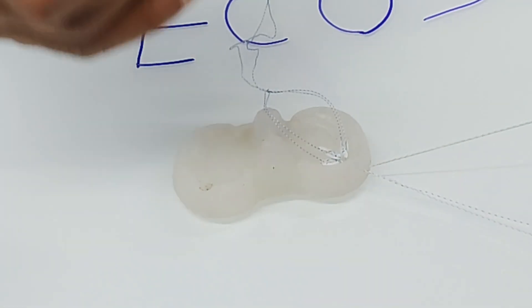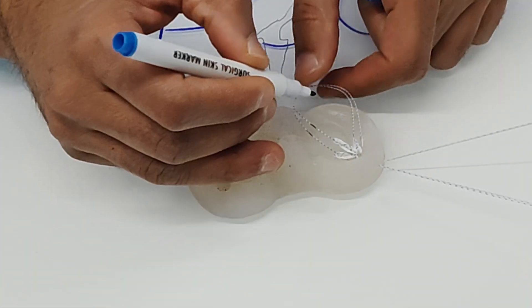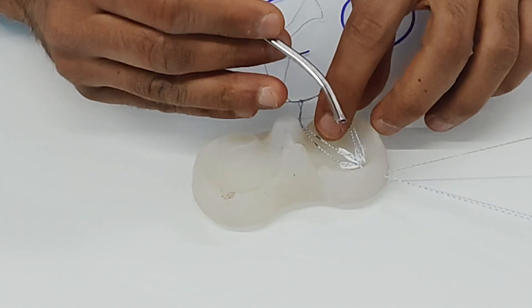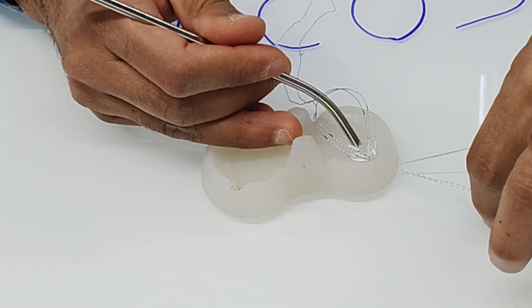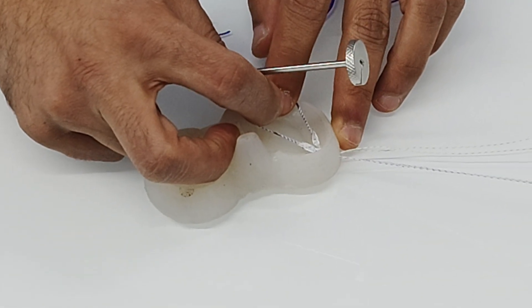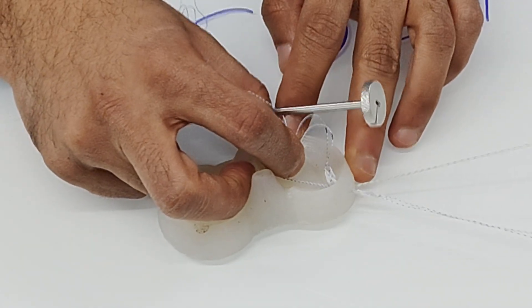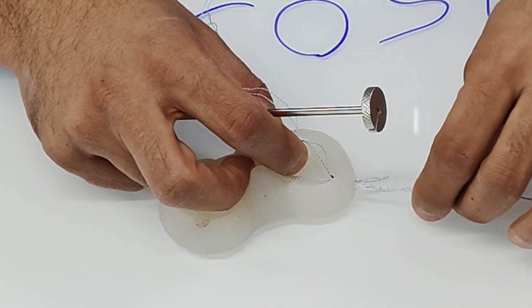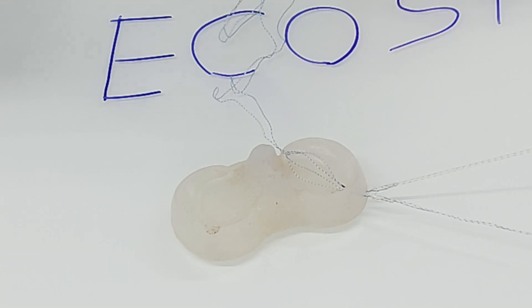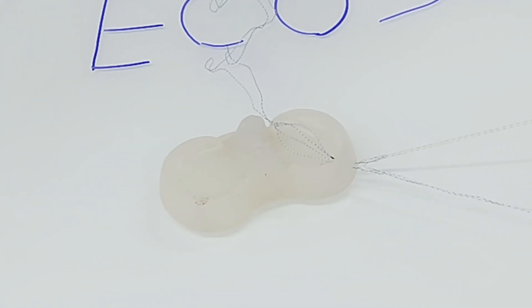One thing you can do is mark these threads before starting, so that you don't overshoot. Both anchors are now sitting on the meniscus — one here and one here. Pull the blue anchor slightly, then pull the green one. Both anchors will go posterior to the capsule. You can confirm this with the marks on the threads, and you will also hear a noise or feel a give-out sensation when the anchor penetrates the capsule.